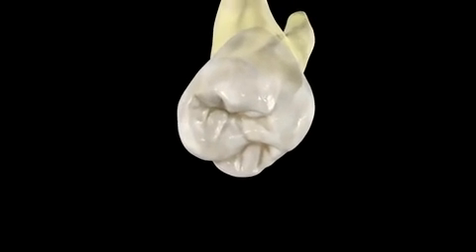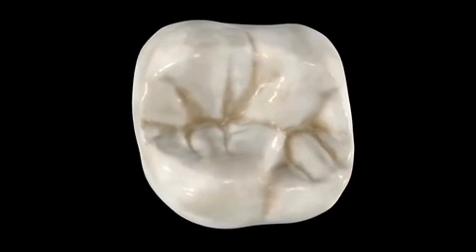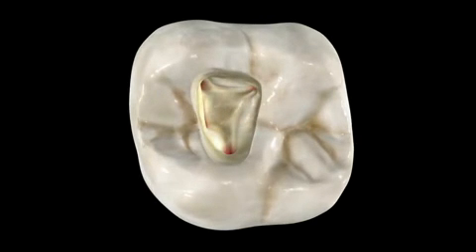Of course, when you look down on this tooth, you're starting to be able to see where you're going to cut your outline pattern, because access is everything in good endodontics. In fact, the access pattern should include the orifices. The size of the access cavity isn't a school of thought.